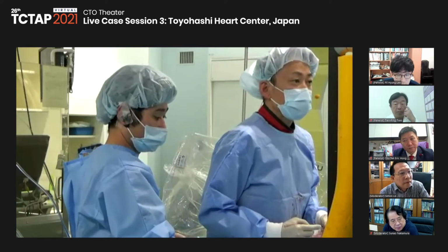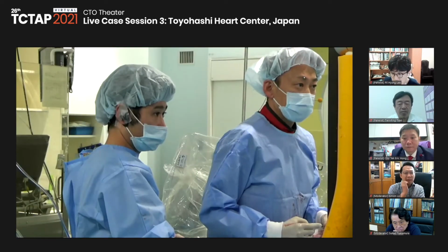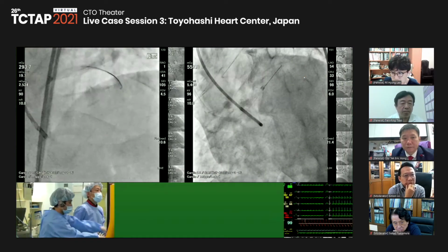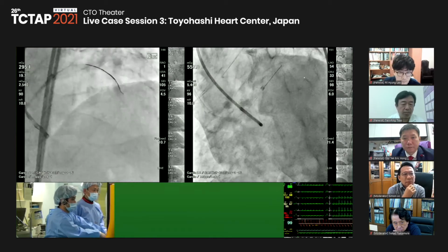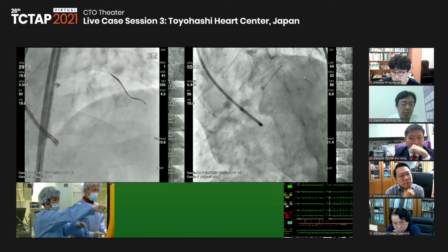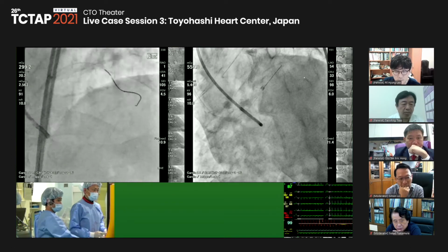But the issue of this case is the cusp is very big. That means it is very difficult to engage the guiding catheter for the right coronary artery. So in this kind of case, I wanted to show the tip injection from the conus branch, but engaging is very difficult.